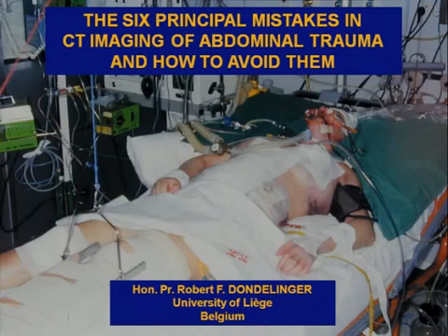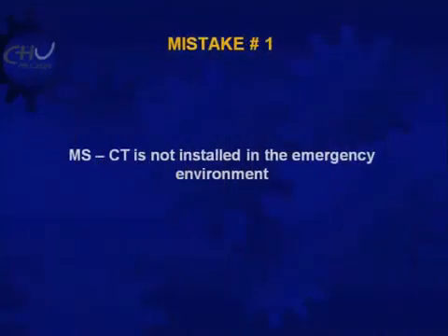So mistake number 1 is certainly a mistake of organization, and it would be a very big mistake not to place the CT machine in the emergency environment. If ever you have an influence on conceiving the emergency environment in your hospital, you have to argue that the CT has to be immediately at the emergency room, and it should even be inside the shock room. This is a very important message.